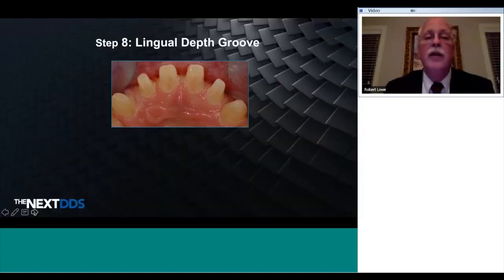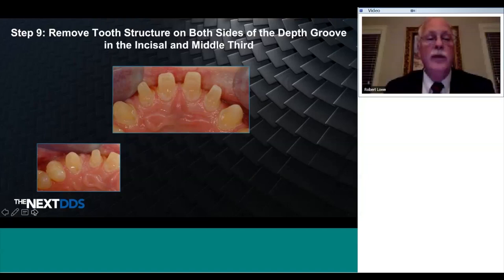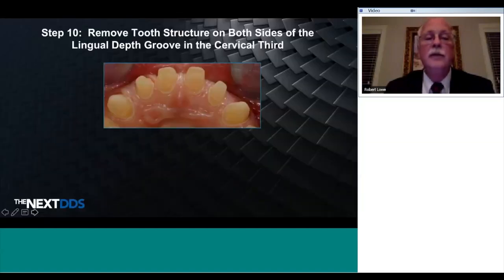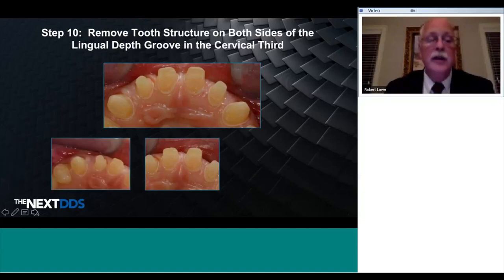Lingual groove, the depth groove on the lingual, right down the center. And then using the elliptical burr to prepare the lingual concavities. That third plane, we'll switch back to the rounded cylinder to create the plane that wraps around the cingulum, which you see here. So we've got uniform thickness of the margin all the way around, following the natural anatomic form of the tooth. I can't tell you how many teeth I see grossly underprepared when removing old restorations on the lingual proximal, and on the lingual margin directly opposing the cingulum or adjacent to the cingulum.